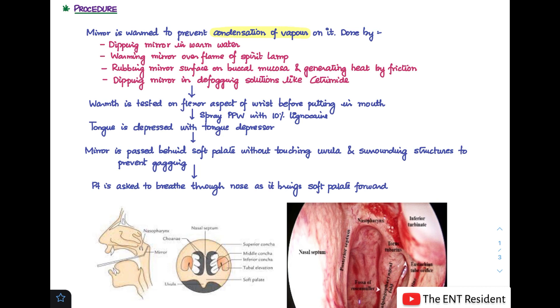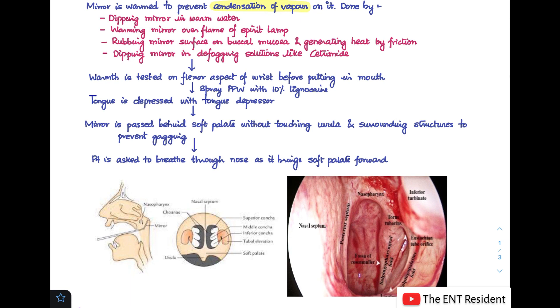After that, depress the tongue with a tongue depressor using your left hand. Once the tongue has been depressed and you can see the posterior pharyngeal wall properly, introduce the mirror — held in a pen-like fashion in your right hand — and pass it behind the soft palate without touching the uvula and surrounding structures, so as to prevent gagging. The patient is asked to breathe through the nose as you perform this, so as to bring the soft palate forward.